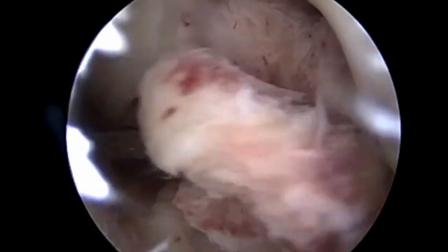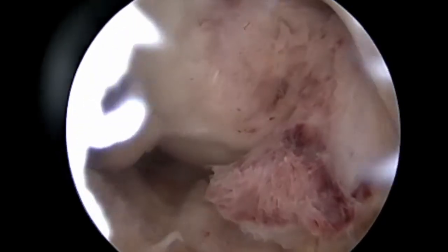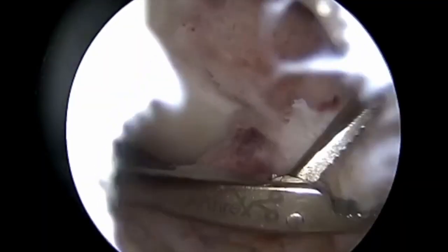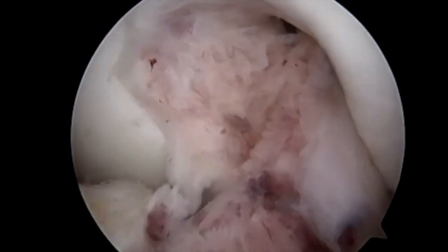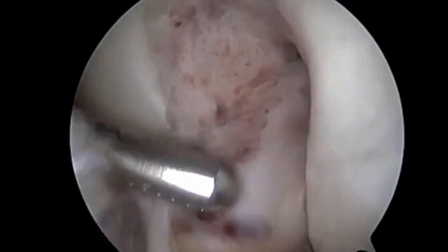An arthroscopic grasper was then introduced to retrieve the Cyclops-like lesion. Alternatively, one can use an arthroscopic biter to complete this process. The excised tissue was sent for pathology review, which revealed benign fibrosis and degenerative necrosis of synovium. The motorized shaver was then introduced once again to complete the final debridement process.